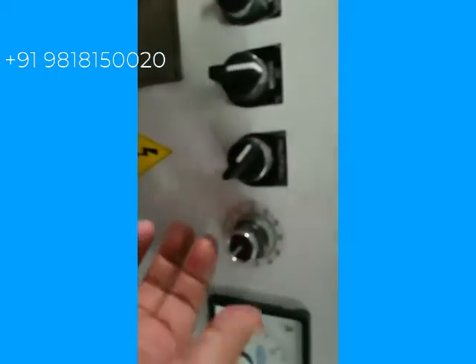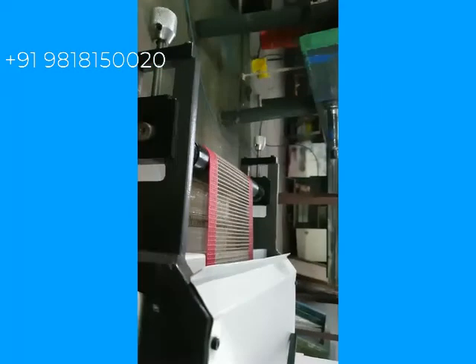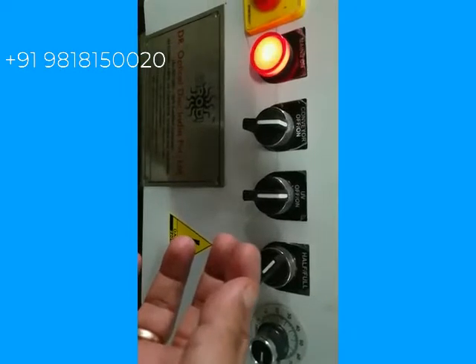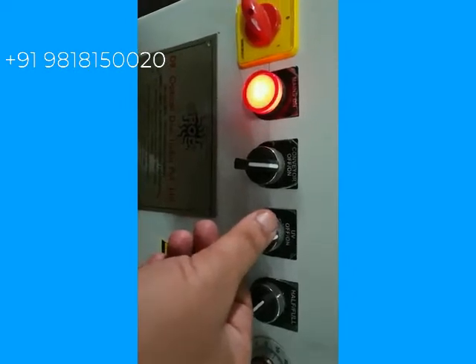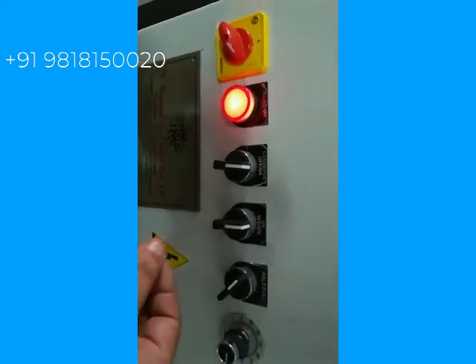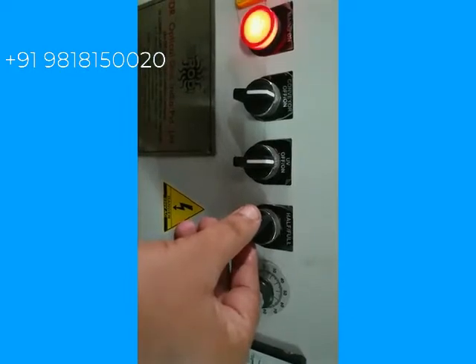From here you can control the speed of the conveyor — you can slow it down or increase the speed. The third switch is for switching on the UV. Now we are switching on the UV.